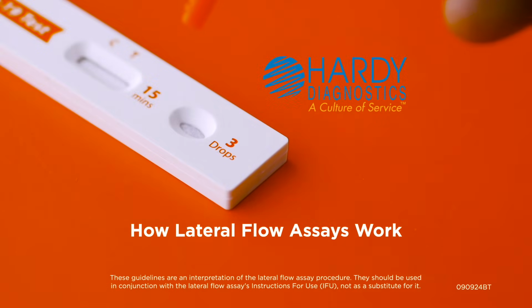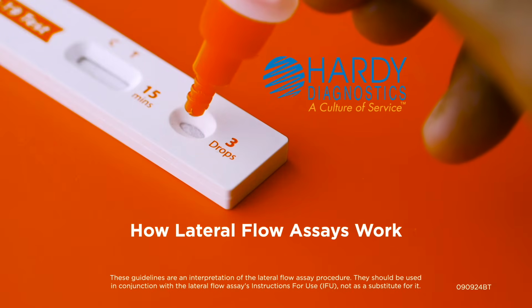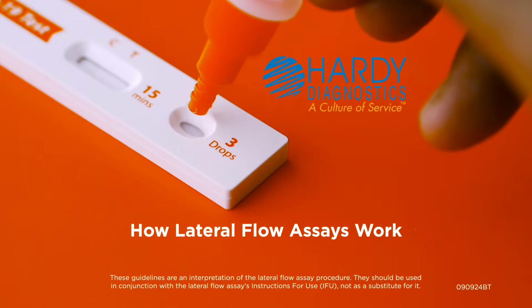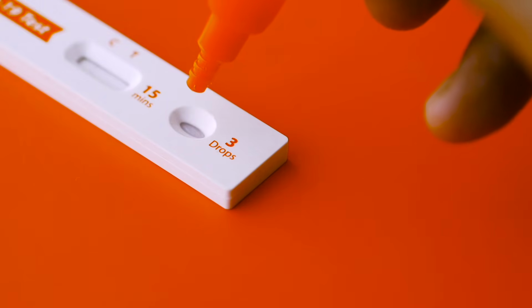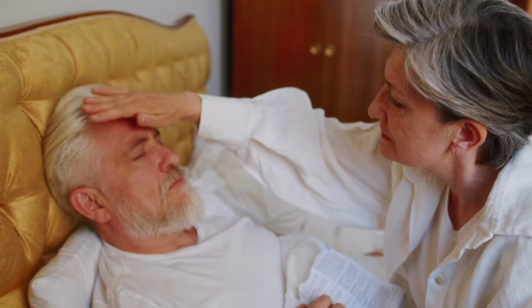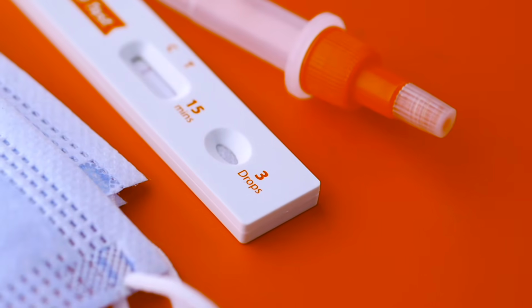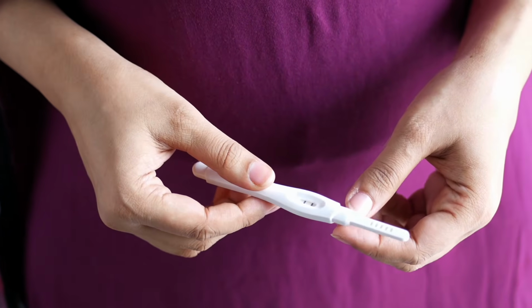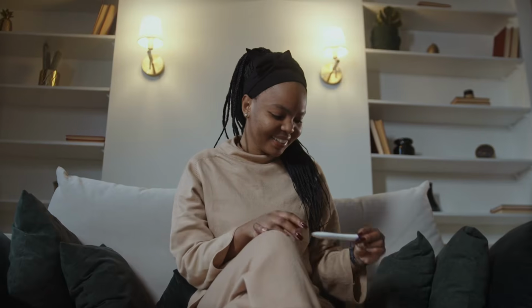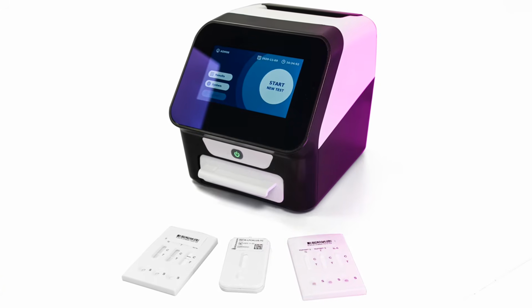Lateral flow assays are low-cost, rapid, and easy-to-use tests which make them ideal for many different applications. In principle, lateral flow assays are immunoassays that utilize antibody-antigen interactions to detect specific targets or analytes. These targets can be anything from infectious diseases such as influenza or COVID to allergens or hormones such as HCG to detect pregnancy. The beauty of lateral flow devices is that they require no equipment. However, a reader may be required if a quantitative result is desired.